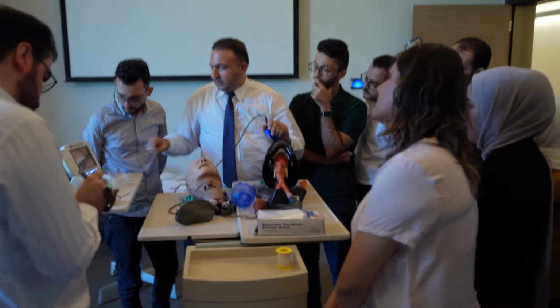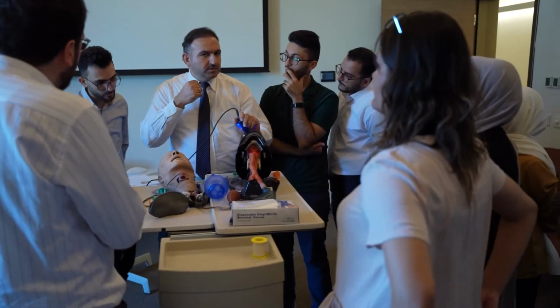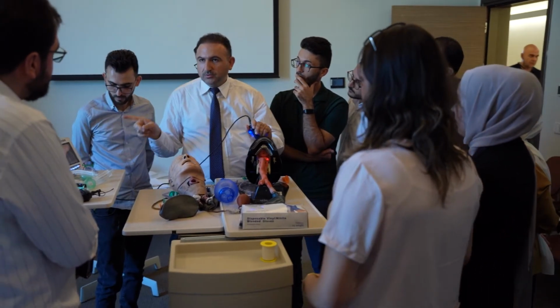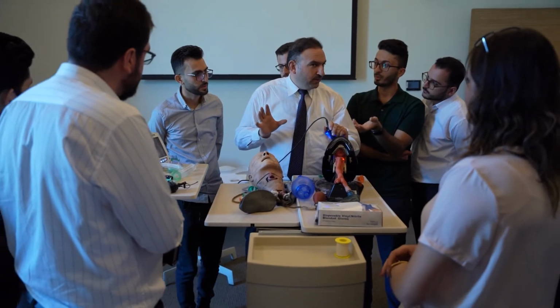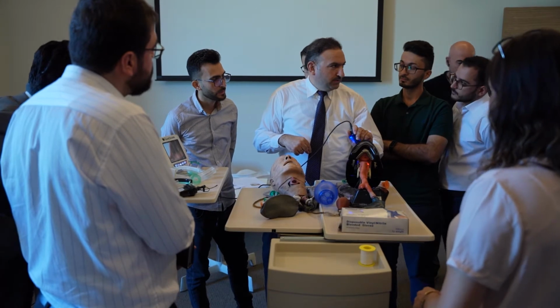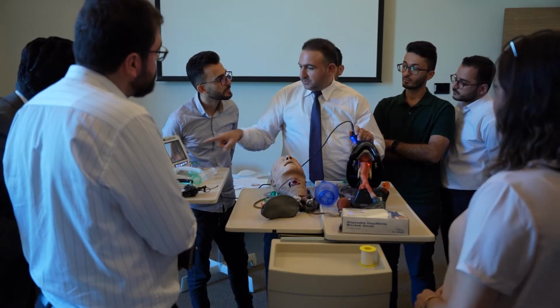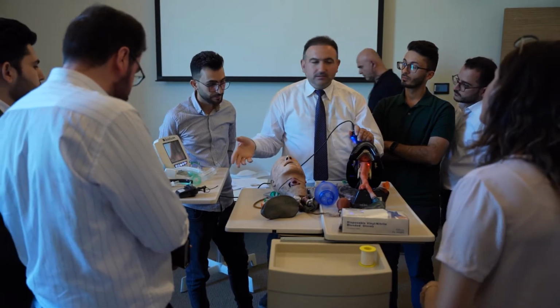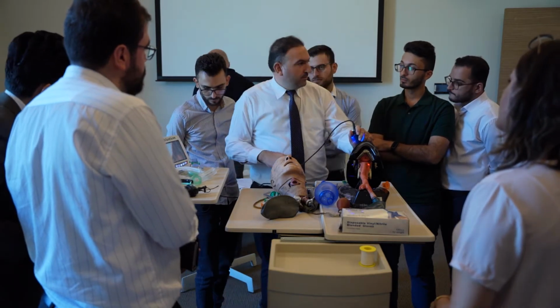Important thing: we should put the blade above the epiglottis, because if we go below the epiglottis, we will injure it. It will swell rapidly. You cannot imagine, and you cannot do a second try of intubation. We always think about a second, maybe third try. Even if we see vocal cords, sometimes you go to the esophagus and even the tube is not in place. So we need to think about the second try.